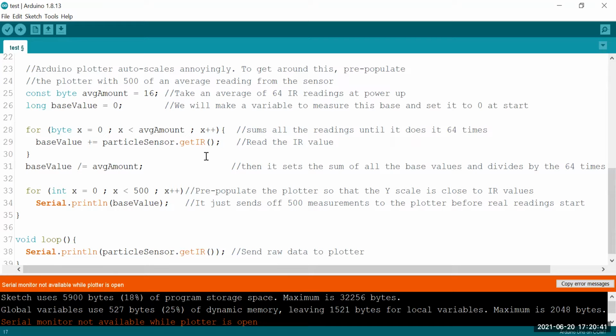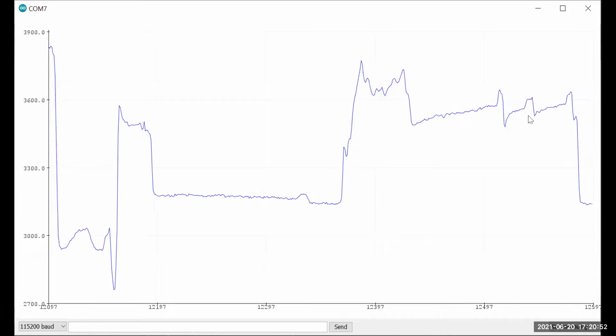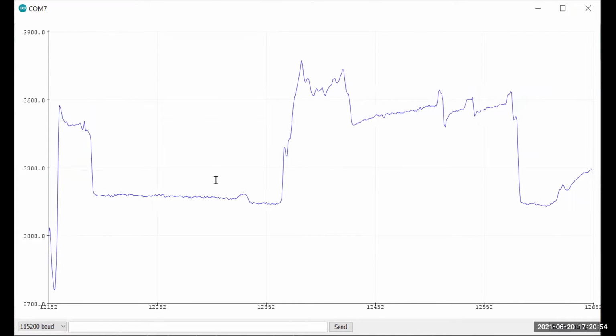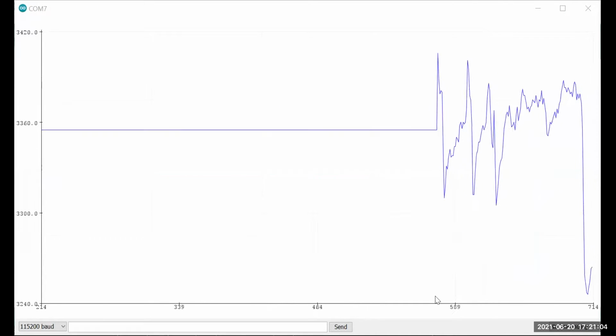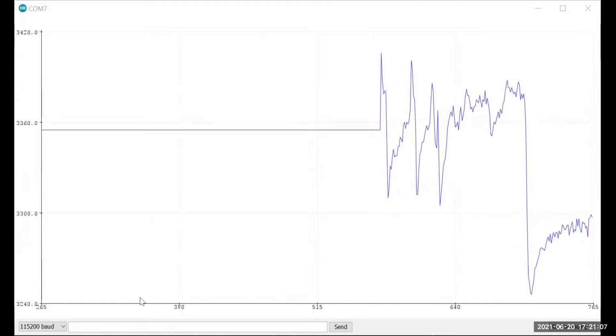This is the little bit of harder part of the code. So I'm going to talk about why it's going on. First thing is just to show you the serial monitor. I want you to notice that on the x-axis, if I get rid of this, go back to tools, go back to the plotter, and I want to show you the x-axis. Note that there are 500 values in the x-axis.